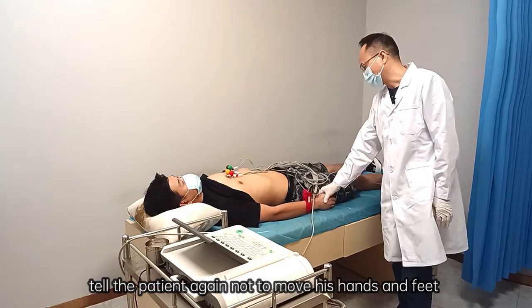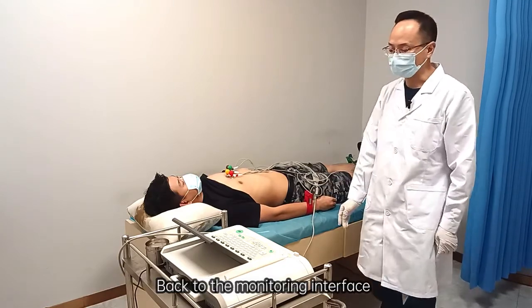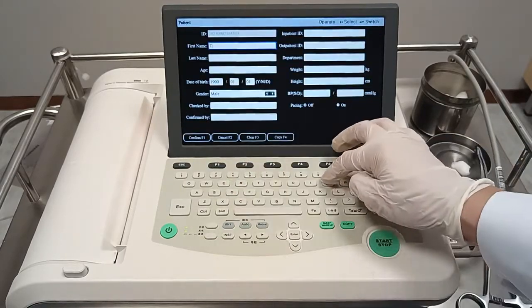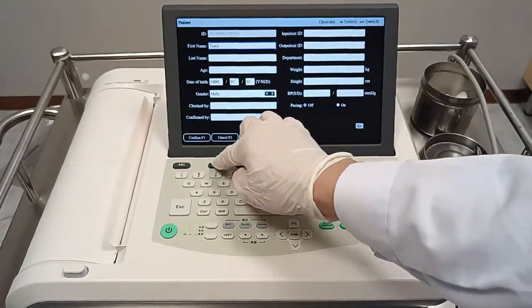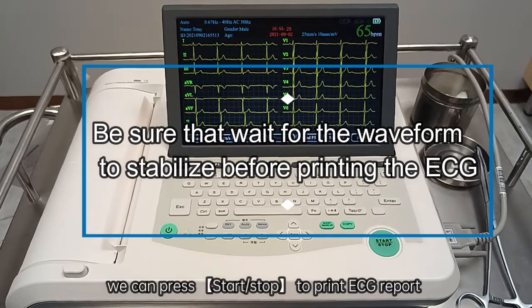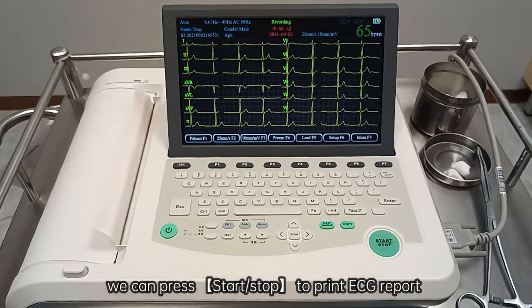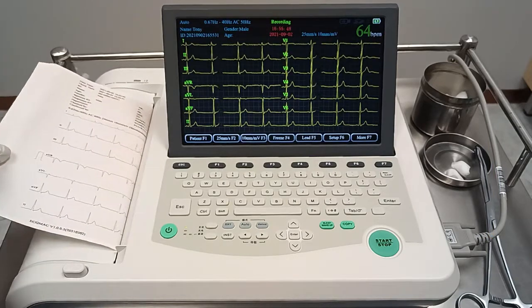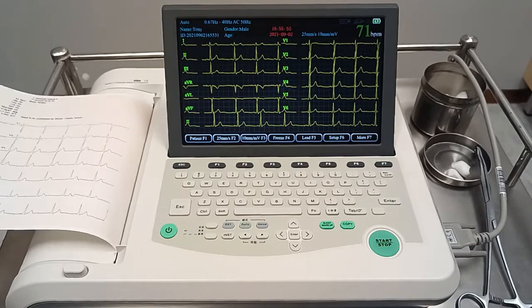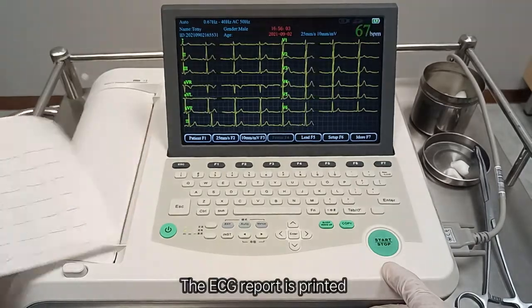Go back to the monitoring interface and first enter the patient's information. After the ECG waveform is stable, press start/stop to print the ECG report. The ECG report is then printed.